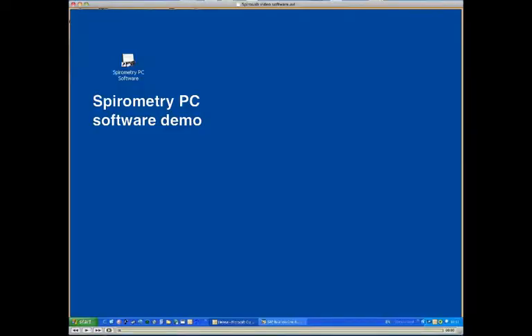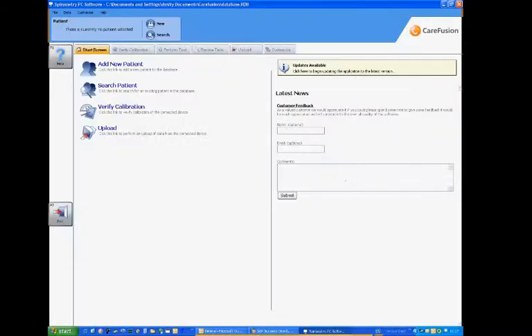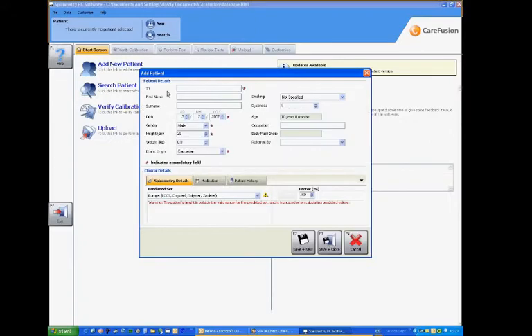So if we now look at a demonstration of the actual spirometry PC software. We'll normally go in and add a new patient. So we'll enter in the ID of the patient — a unique number — and in this case we'll enter Joan Test. And we'll give her the date of birth as the 23rd of the 2nd, 1956. And obviously this patient is female.